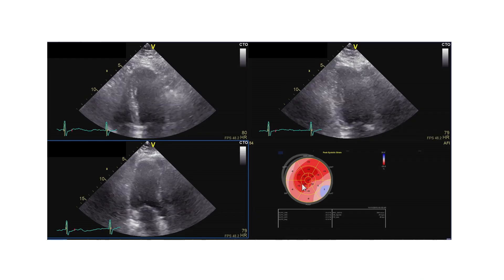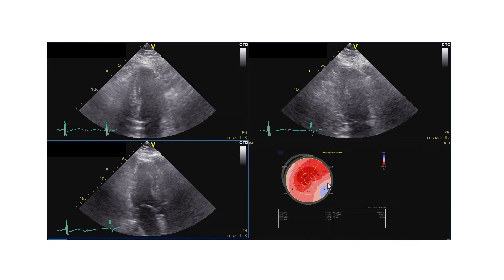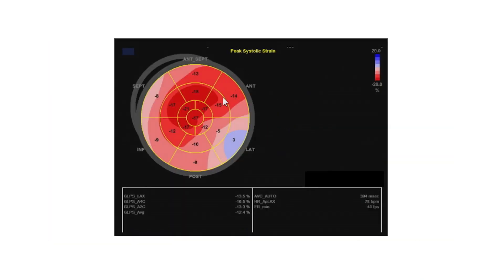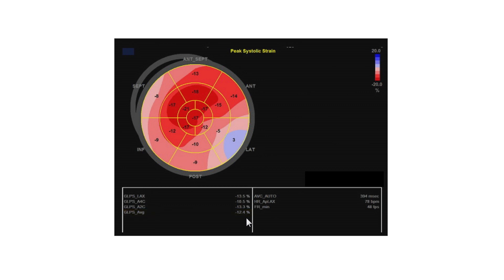But with the bullseye display, we can also see where the problem lies, especially in the basal segments of the myocardium. The global longitudinal strain is minus 12.4, which means she does not only have diastolic dysfunction, but also at least subclinical systolic dysfunction.